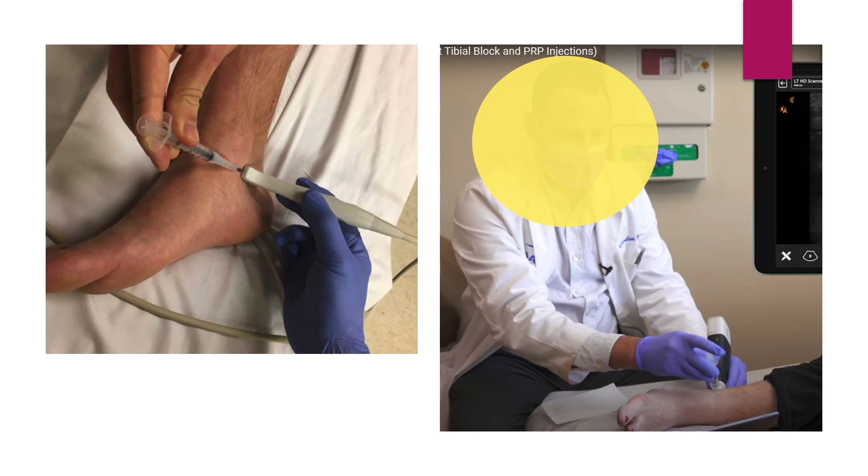The medial malleolar area is more sensitive than the thick posterior skin. So puncturing the skin in the posterior region is more acceptable for patient comfort.